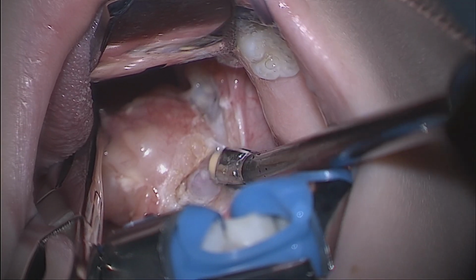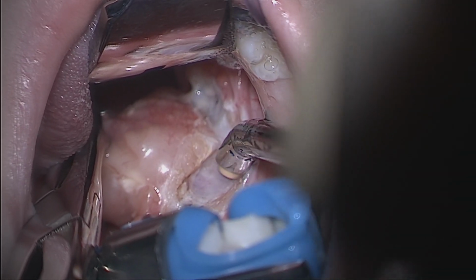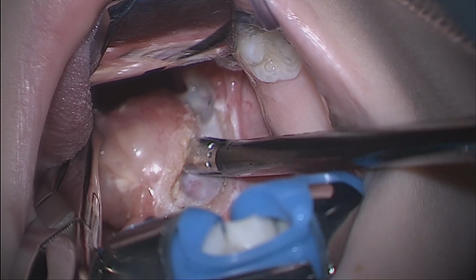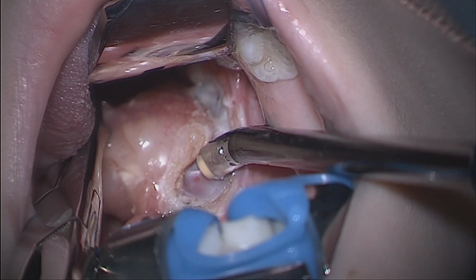The wand of the coblator is shaped to provide a broad surface area at the tip. This can be used to gently dissect the capsule away from the underlying fascia, with the coblation function reserved for thicker bands which are not readily dissected in this way.